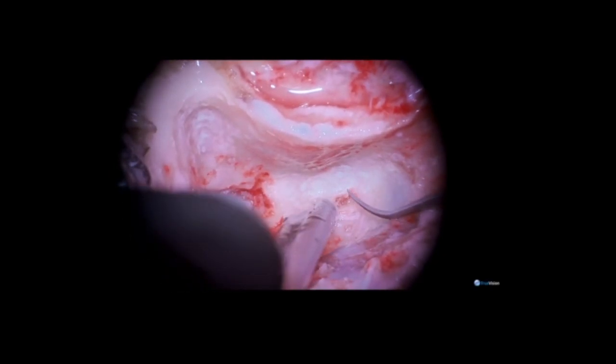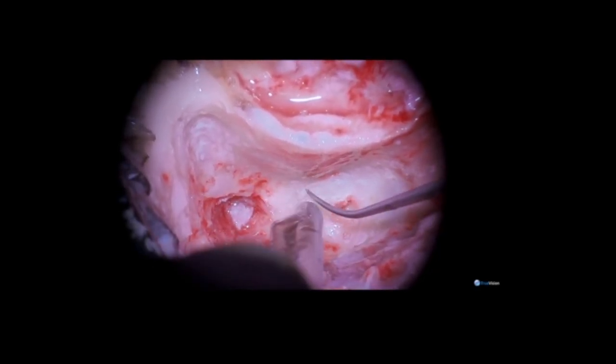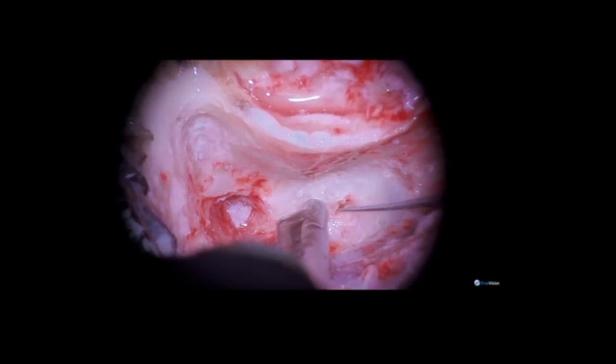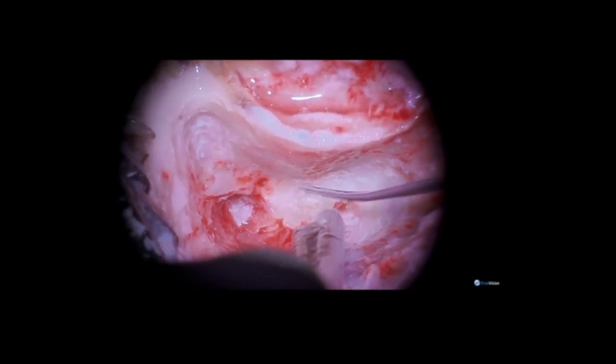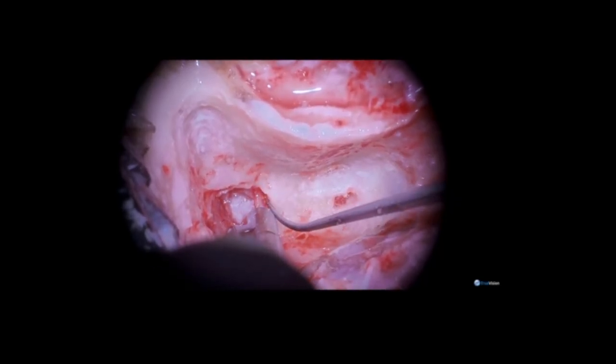Using a curved Rosen needle, you can pick at the air cells and define the exact extent of the posterior canal wall to not penetrate it.